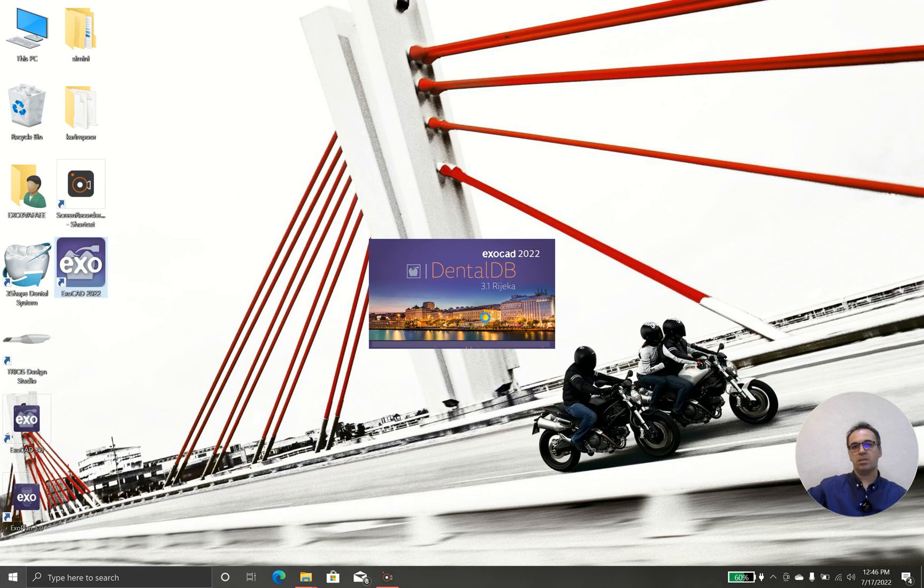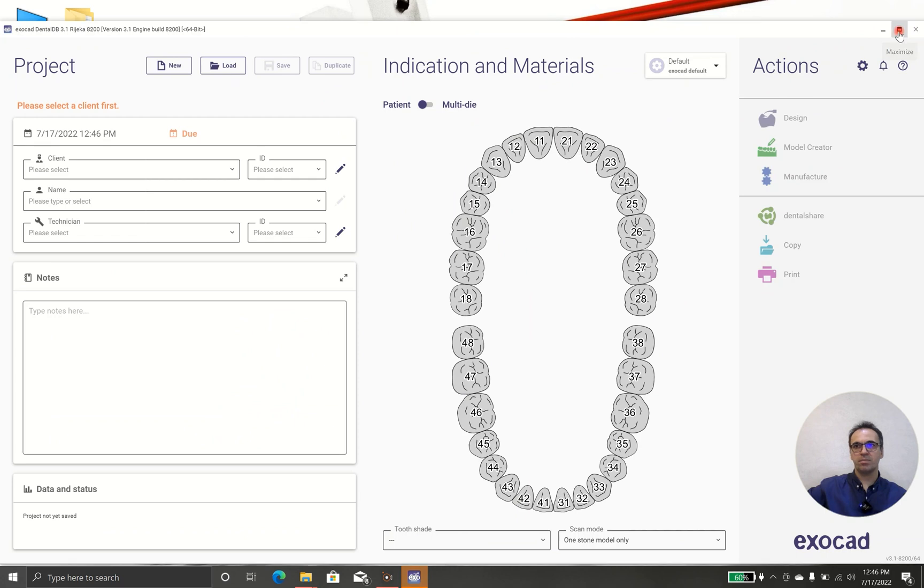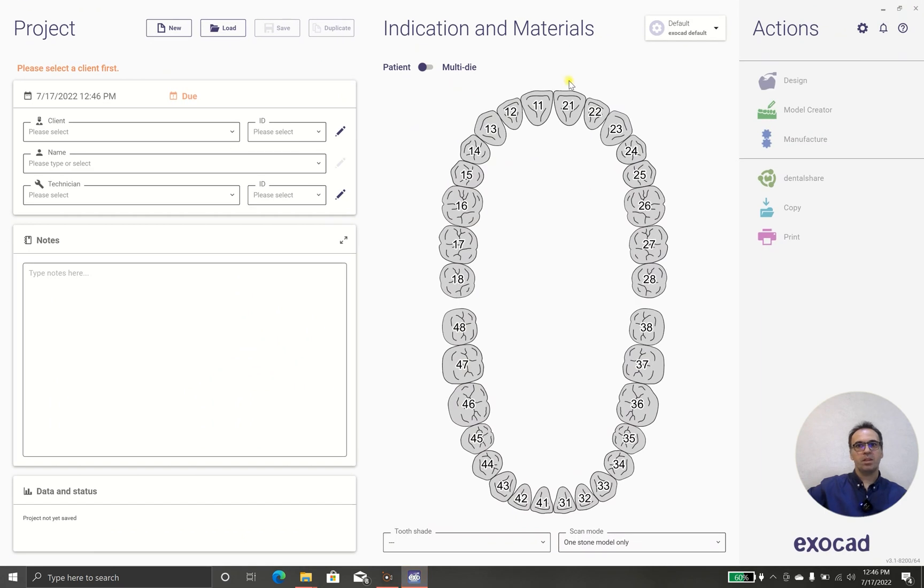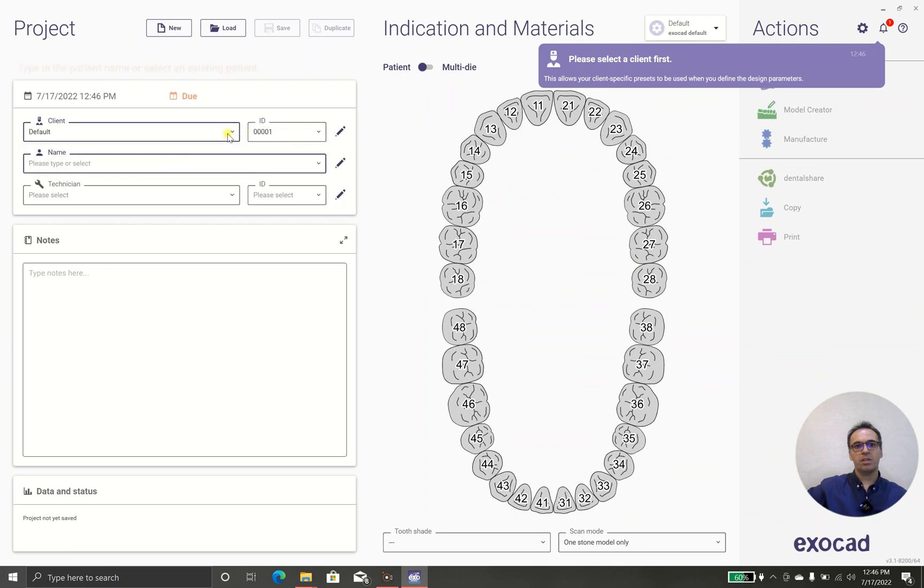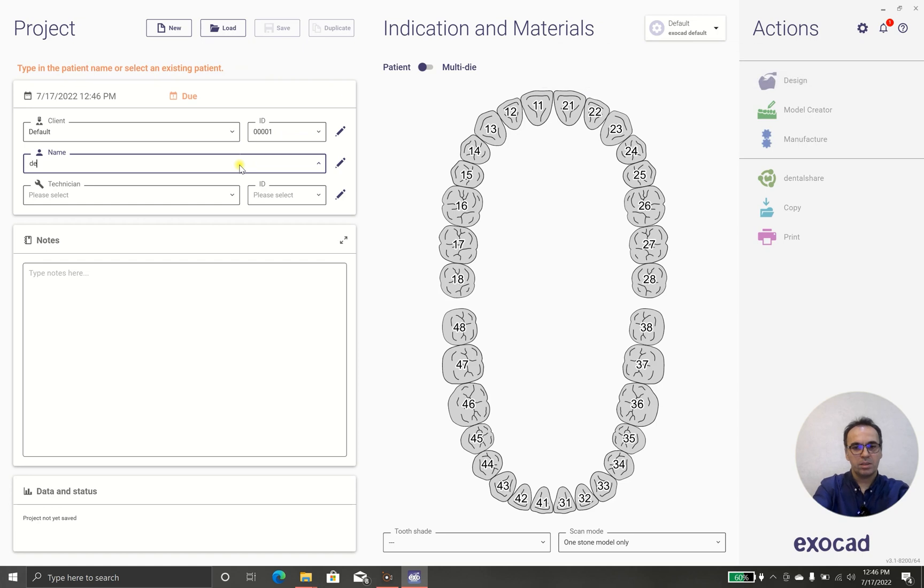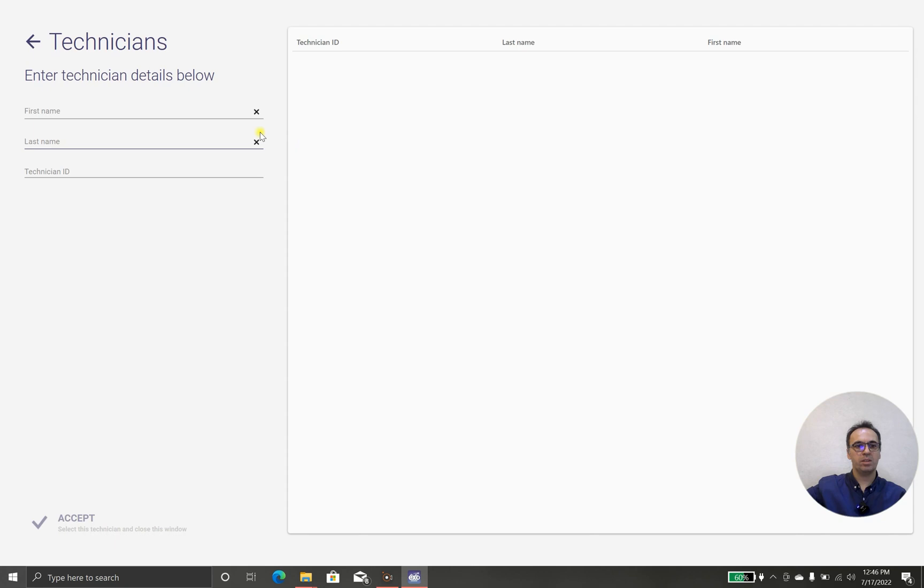Okay, the dental DB is a little bit different, not too much but it's a little bit different. In this case we are going to have client default, I will change it later to demo laminate and technician. We don't have any technician, we need one.